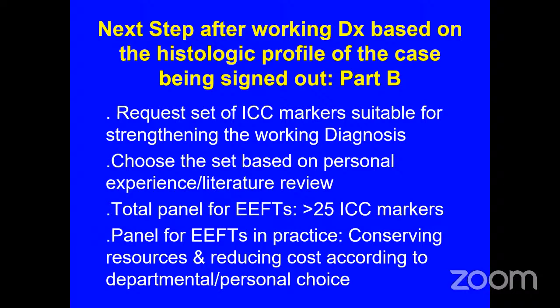So the IHC markers that I'm giving in this presentation are based on my personal experience and literature review. But when it comes to your choice of these markers, you have to depend on your own personal perspective and your resources. Because the total panel of IHC markers consists of more than 25. And what we can have in practice in terms of the resources and conserving resources and reducing costs is something that you will be able to decide on the basis of your departmental and personal choice.